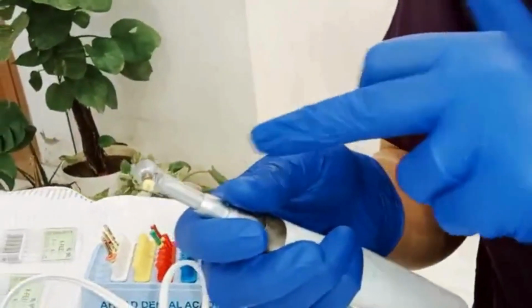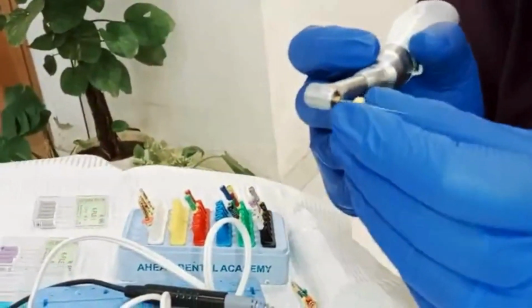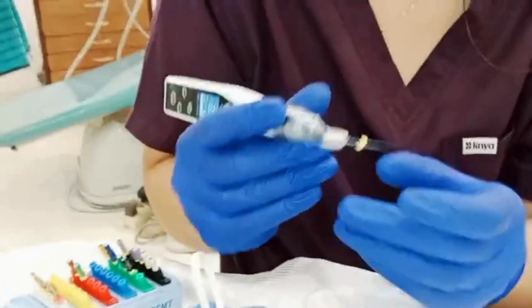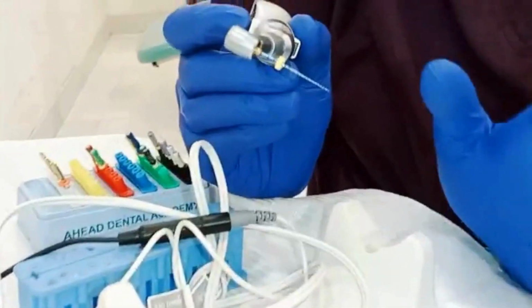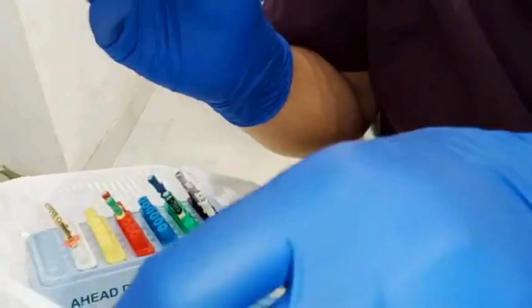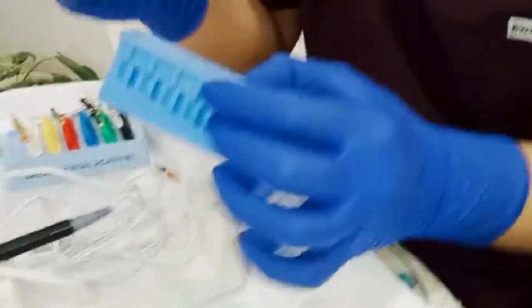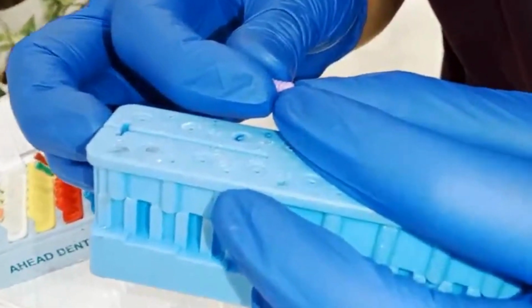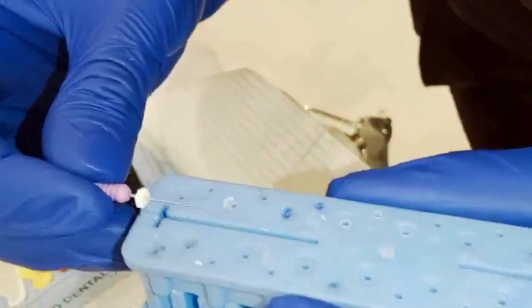It is 17 or 15 in different companies. So we don't need to pre-curve these rotary files. Okay, so they'll go straight away. So now since I have taken a working length and I have measured it like this, just like our working length is 17.